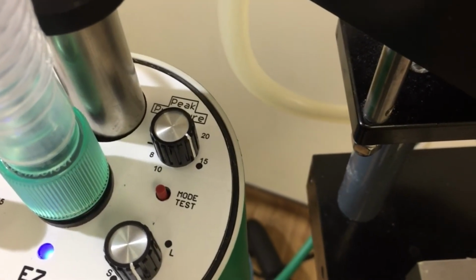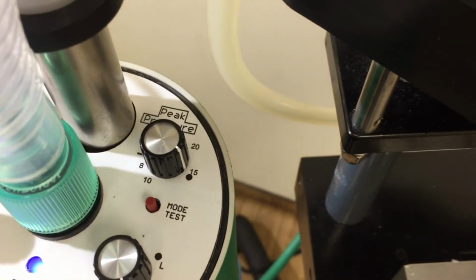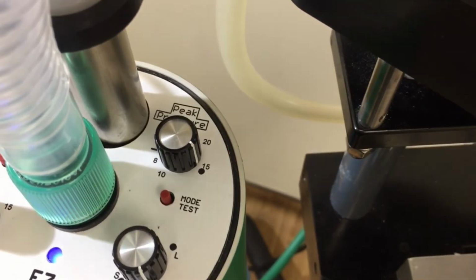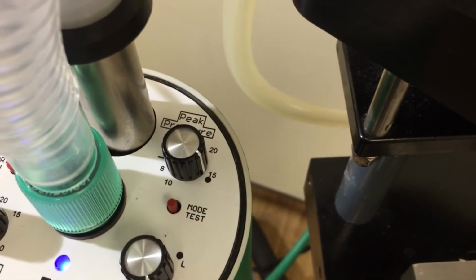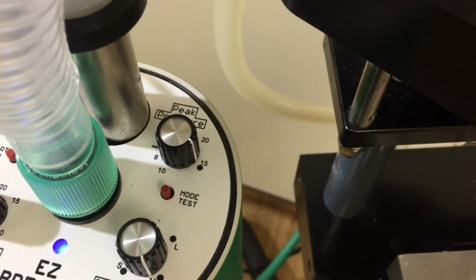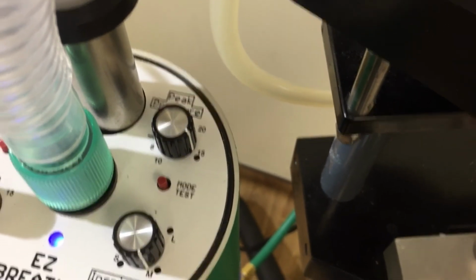There are a number of different reasons for changing the peak pressure, though most patients will ventilate quite well at 15 centimeters of water. One reason might be obesity, in which case you would want to increase the peak pressure. Certain types of lung disease might require you to decrease the peak pressure. In any case, look at the patient. What you want is the patient to be taking nice, normal-looking breaths with the chest expanding in a nice, comfortable way.